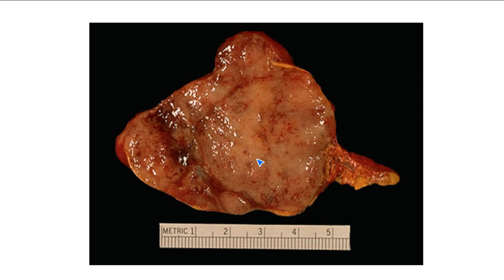All right, so the individual cells now, how do they look? The nuclei in neuroendocrine tumors show this characteristic feature. What is that feature? Remember, in pathology, we like to make analogies to food. What type of pattern do we see in the nuclei of the cells, in pheochromocytoma and in other neuroendocrine tumors too?